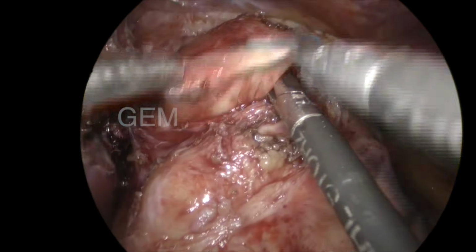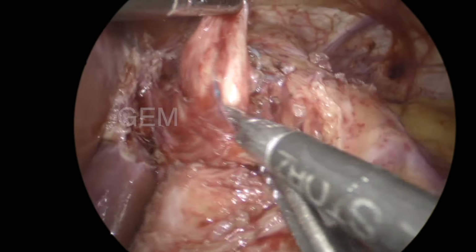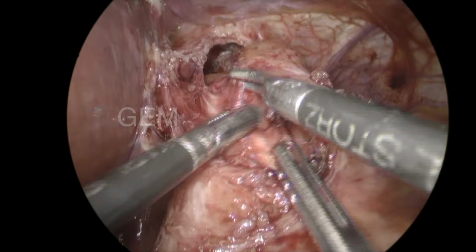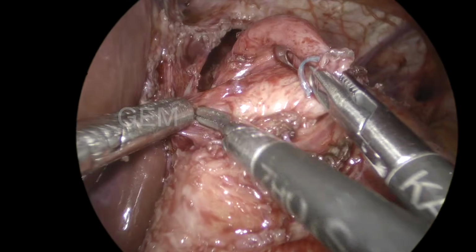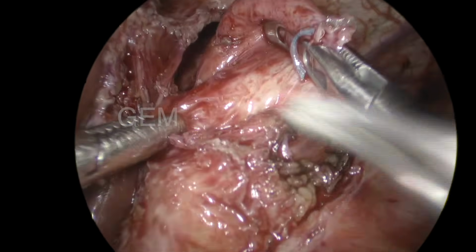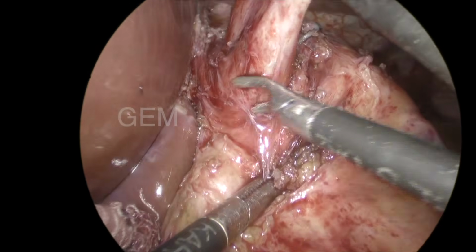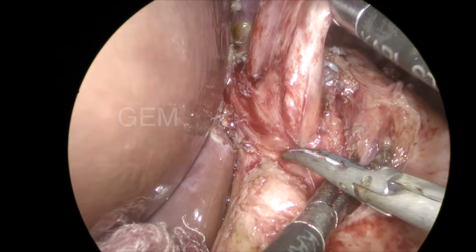Second, the fundus is coming. Again you can see the suture. So many sutures done. So I am dissecting. I want to see the edge of the fundus. Then only I can divide. I don't want to divide blindly, because that will make a serosal tear or injury. So I don't want that.